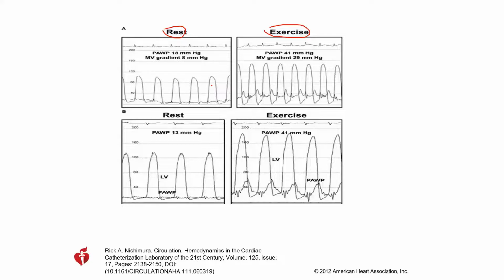During this time, you might lose the heat of the moment, the heat of the exercise. So the bicycle ergometer is the best setup for the cath lab and echo as well, for this kind of hemodynamics. Okay, look at the other patient at rest and at exercise. Look at the gradient. It is a very small gradient. Mitral stenosis gradient is very small. Maybe it's like 3-4. It goes a little bit higher to maybe 5, something like that.